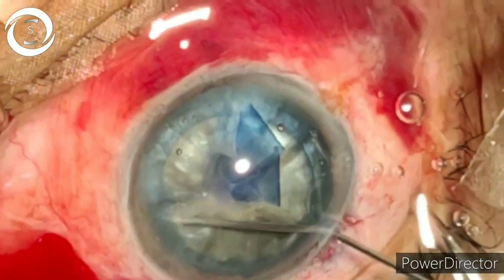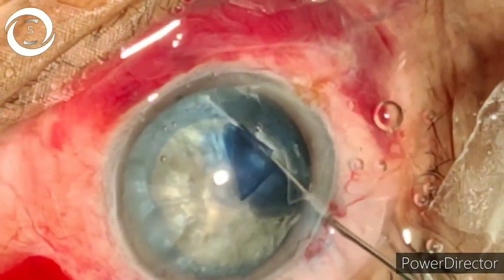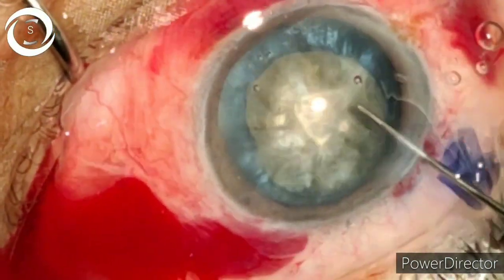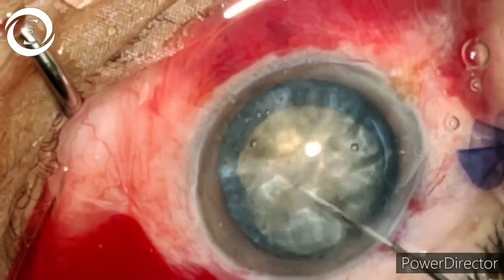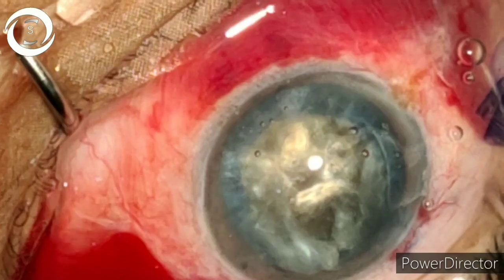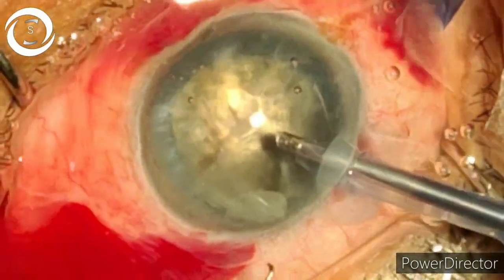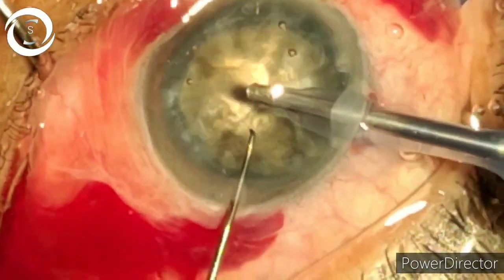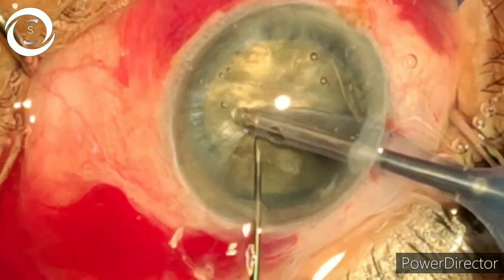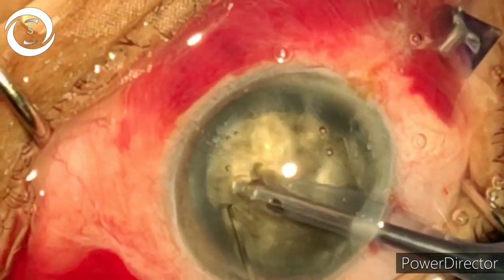Now hydrodissection and rotation of the nucleus. Because it's a very hard cataract there is not much cortex present. So again viscoelastic, and now with high parameters — 80 feco power and 350 vacuum — I am starting the phacoemulsification, making a little groove in the center.